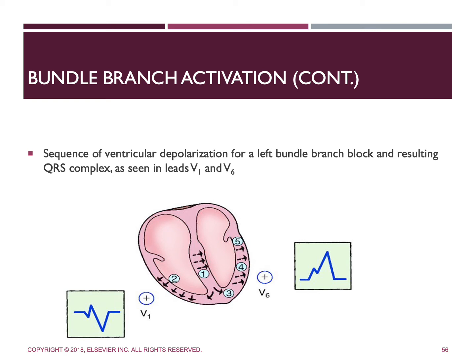So, for example, from right to left. Now, thus, the wave of myocardial depolarization begins with the net movement of current going away from V1 and is recorded as an initial negative deflection. So the right ventricle is depolarized next.